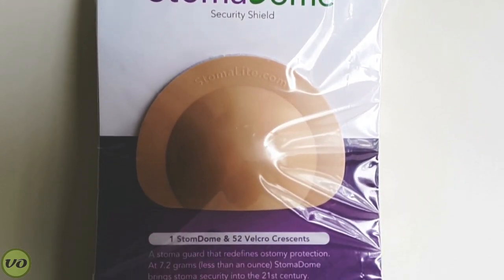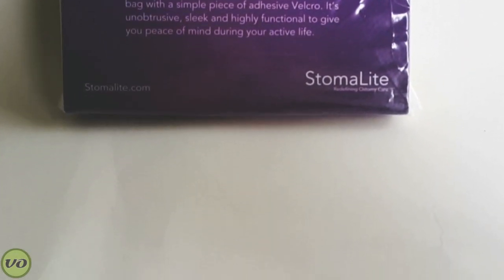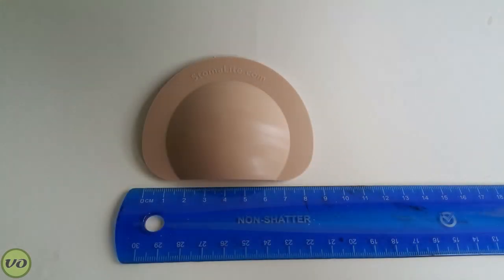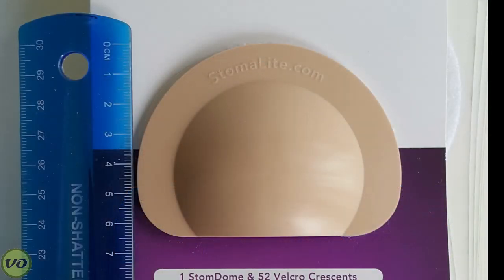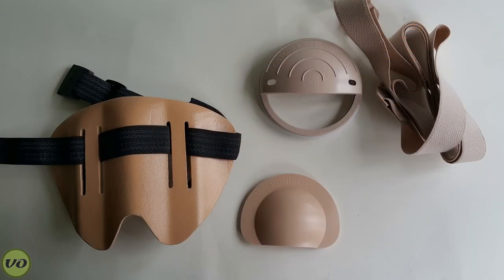One of the things you'll notice right away about the Stoma Dome is the fact that it's really small. I'll put the measurements on screen, and I'll throw up a comparison between a couple of other guards that I've reviewed — you can see that it's just tiny in comparison.